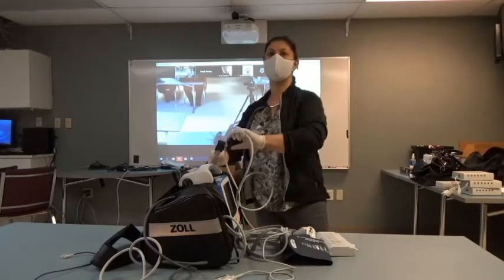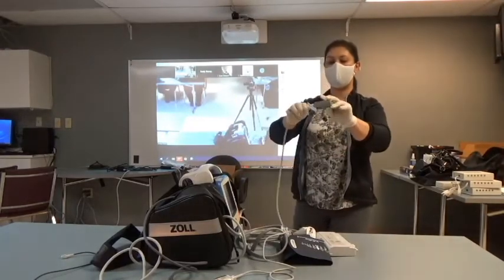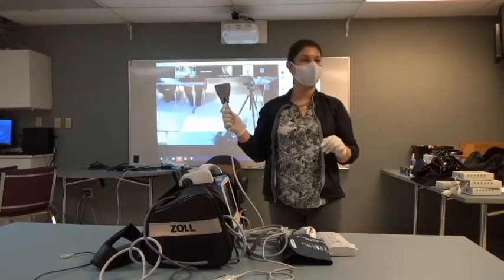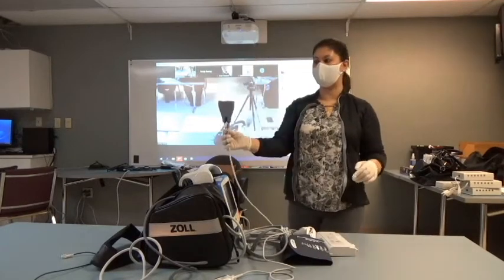When you're done, it is really important that you disconnect this and you put the gray adapter back on. If you leave them connected, it's going to give you an error message that says short detected. So always disconnect and put your gray adapter back on.